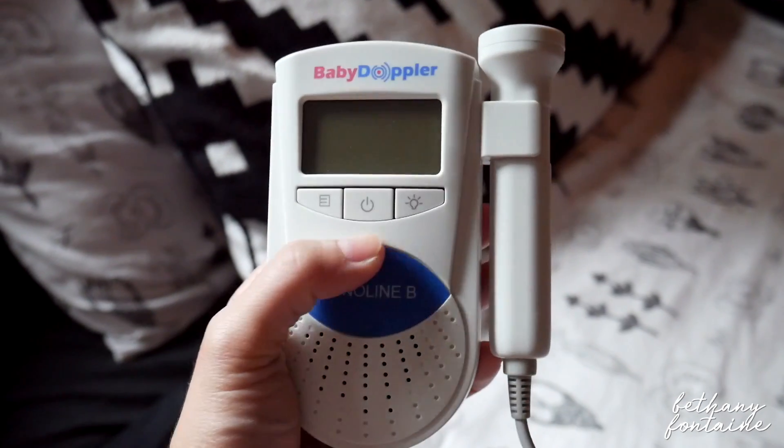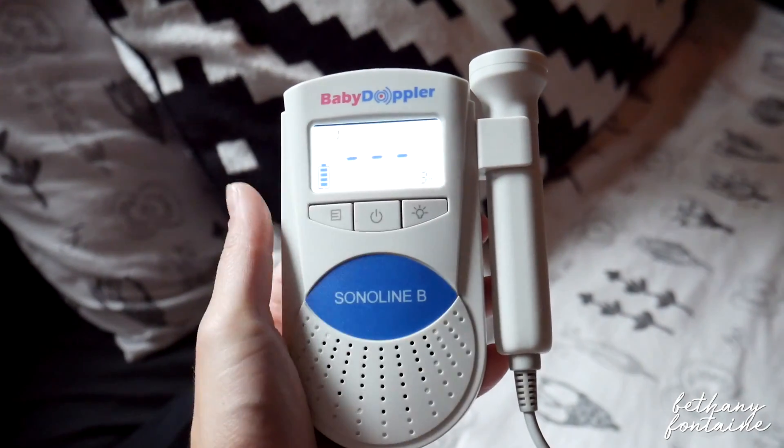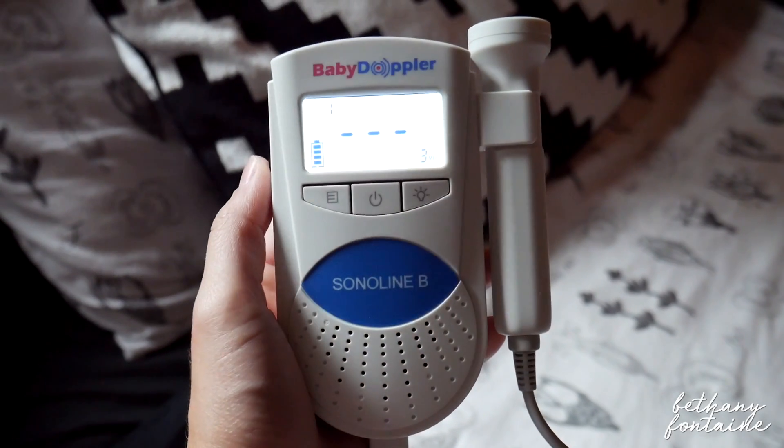First, I'm just going to be showing you guys how to use the at-home Doppler. We have here the probe and we have here the machine. You can turn it on with the power button, and it has a really great little LCD screen where you can see the baby's heartbeat and see if you're catching anything on the Doppler.